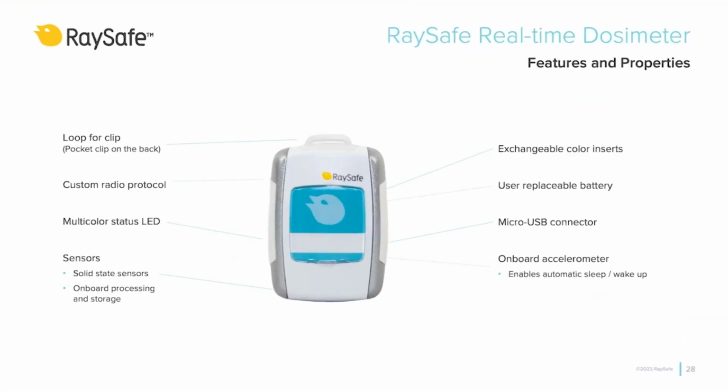Over time, this helps users build a better intuition, adapt and learn what works and what doesn't, in terms of keeping radiation exposure as low as reasonably achievable. To start with, let's have a closer look at the dosimeter itself.